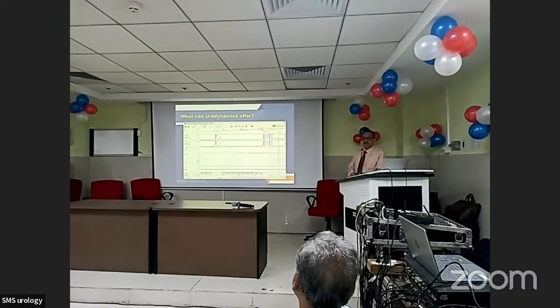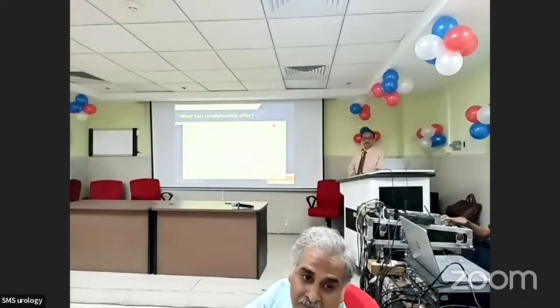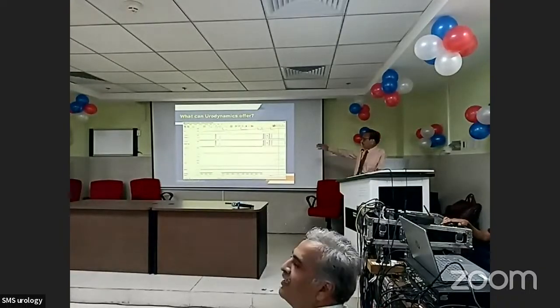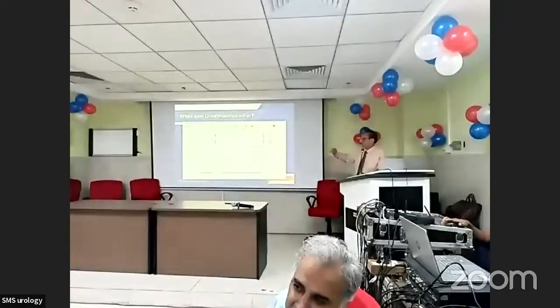Is she voiding only by relaxing the pelvic floor, or is she voiding by contraction which is not recorded? The transducer may have come out, or it may be an artifact. Maybe the transducer came out while voiding. No, it is there. Nothing wrong with the transducer.